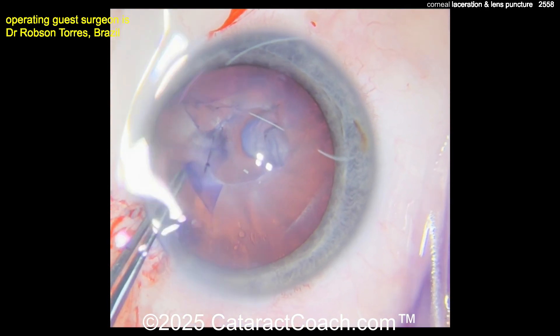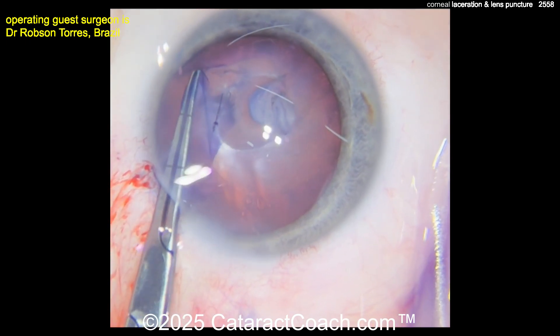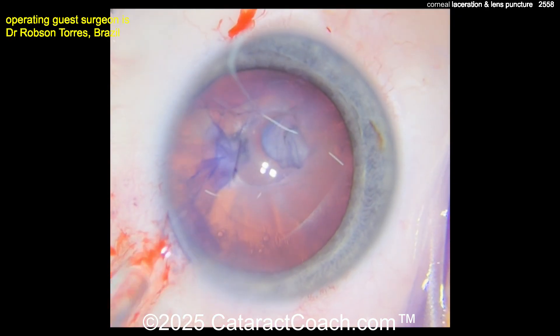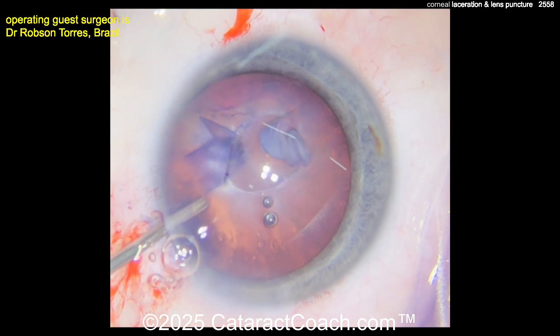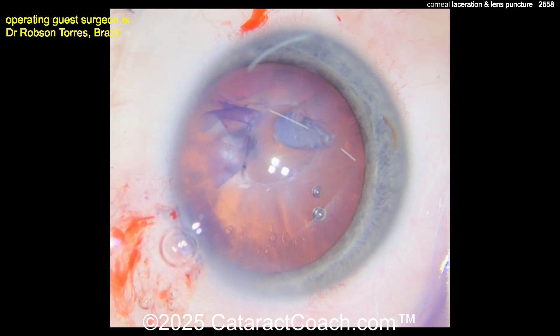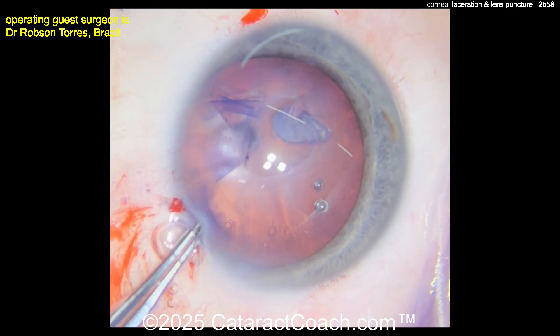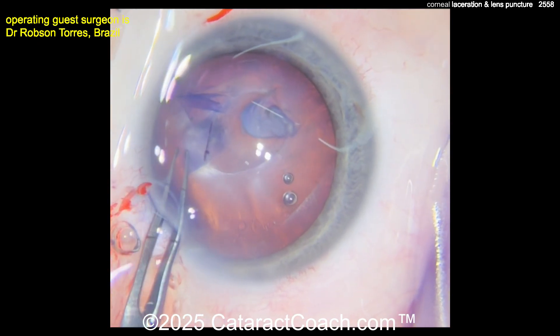This is not a dense nucleus — this is butter. You'll probably take the entire lens out with just the IA probe; I don't think you need a phaco probe. Completing that lens capsule opening here, and I'm glad the surgeon is taking time to put in more viscoelastic and really make the rhexis as round, centered, and strong as possible, even though there is a radialized part of it.